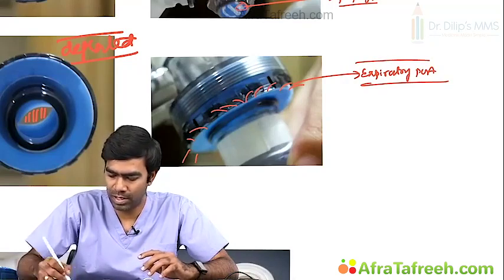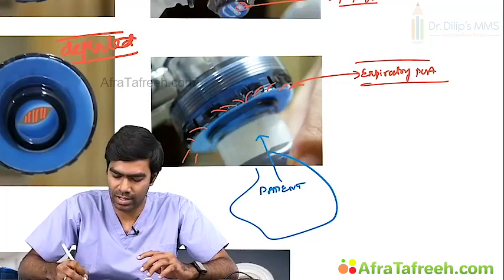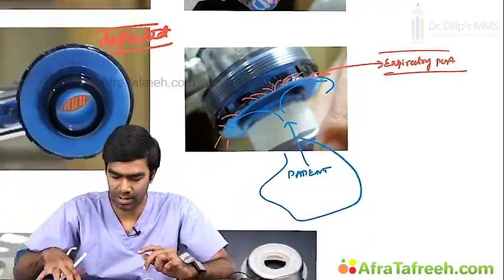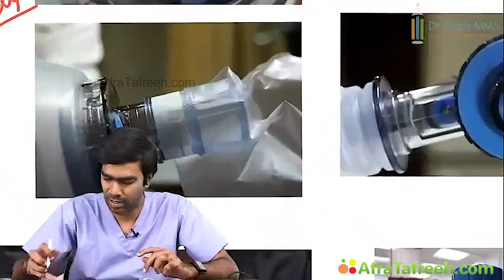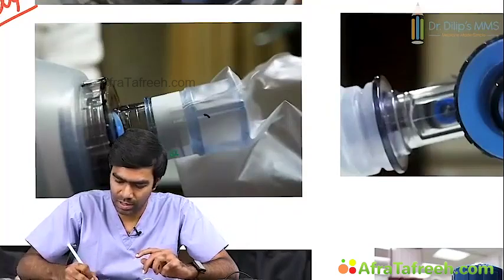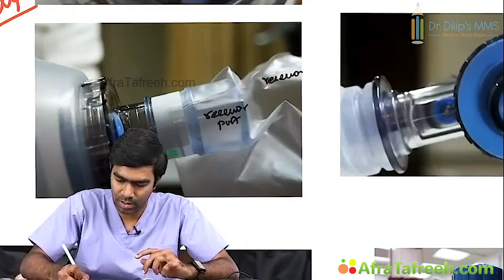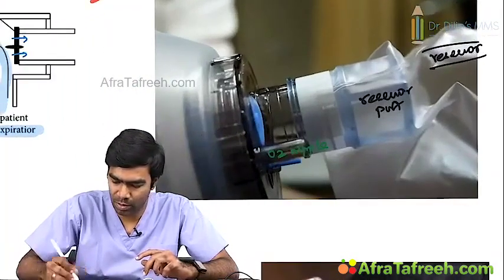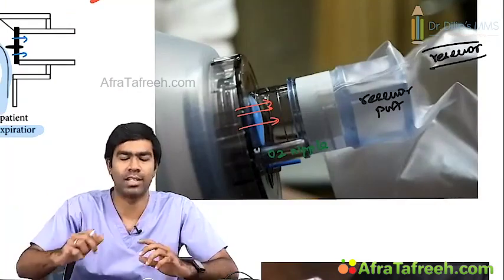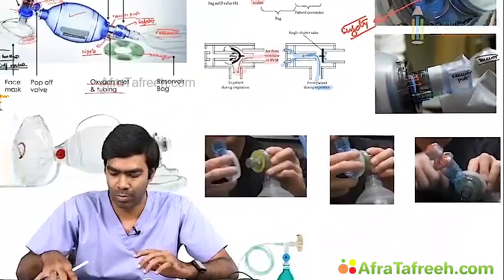So which means the patient will be here, the mask will be here, and when the patient exhales, the gases will come out through the expiratory port rather than entering into the self-inflation bag again. Clear? And this is another angle showing the inlet valve. So this is the oxygen nipple here, and this is the reservoir port, where you have the reservoir connected. And you can see this is a safety valve again. It might open in times of emergency. It can push. Similarly, you have another safety valve also which can take the gas from the atmosphere in case of emergency, malfunctioning of the oxygen flow.